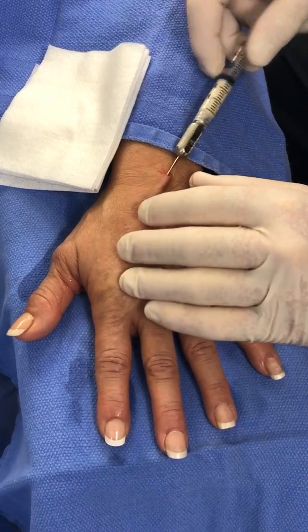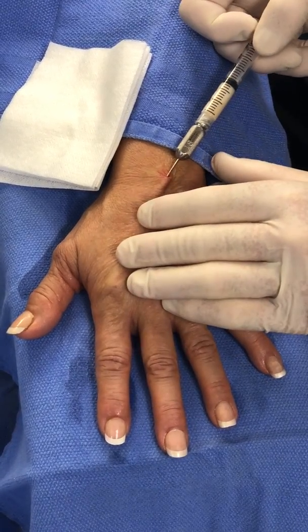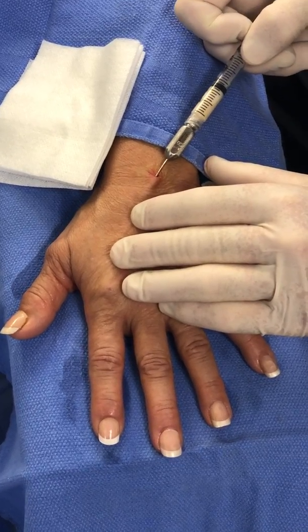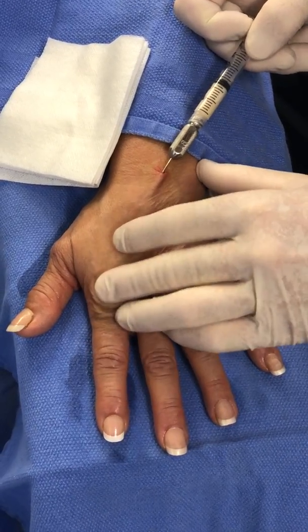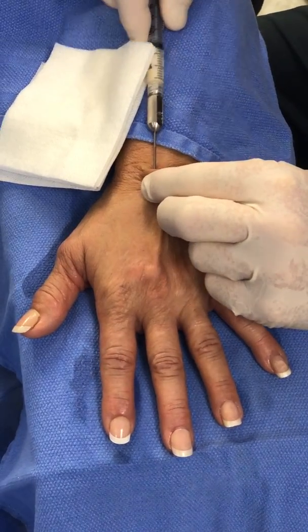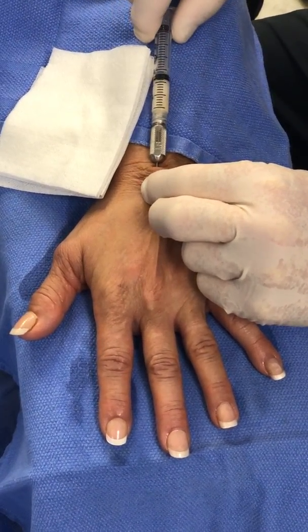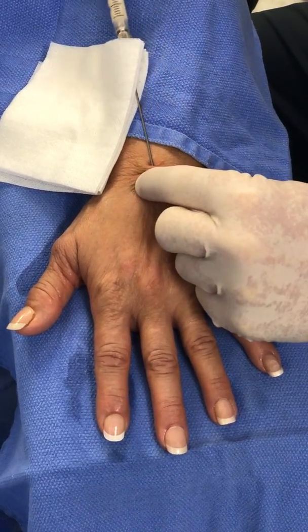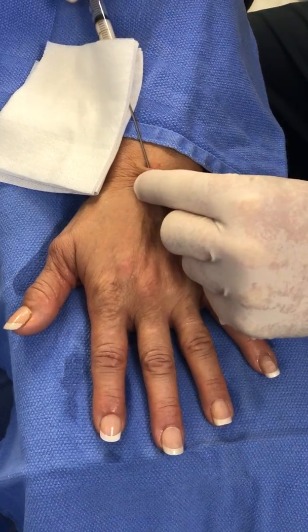I've pre-injected the knuckle pads right here with a little bit, and I'll put about 0.3 to 0.5 cc over each knuckle pad to rejuvenate that skin. I do inject a little bit of local over here because this can be a little bit uncomfortable distally.